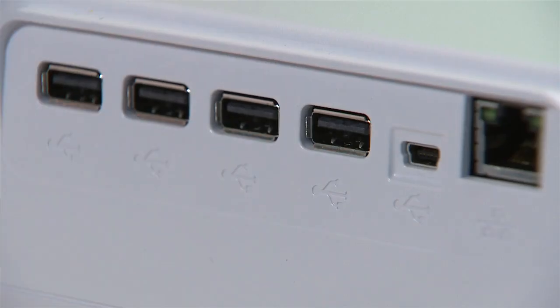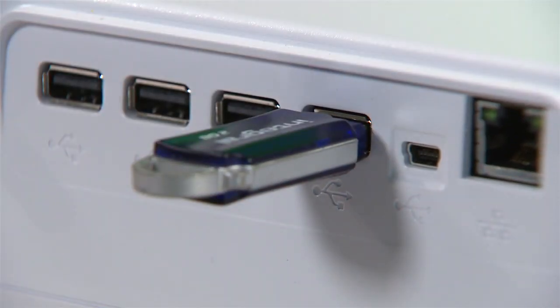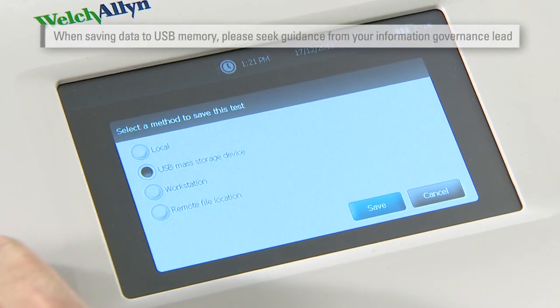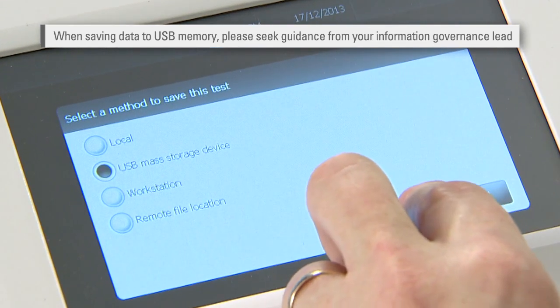The memory of the CP150 can hold up to 100 ECGs. But if you'd rather save the ECG to a USB mass storage device, you can change the settings under auto report on the ECG unit. Then simply plug a USB storage device into a port at the back of the unit, press save, and choose the USB mass storage device option followed by save.